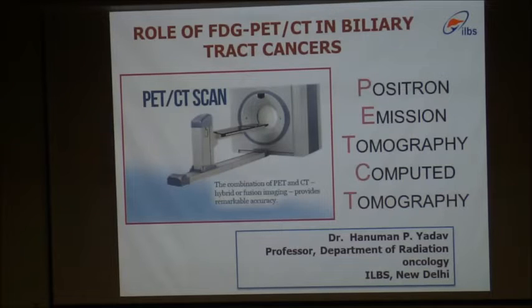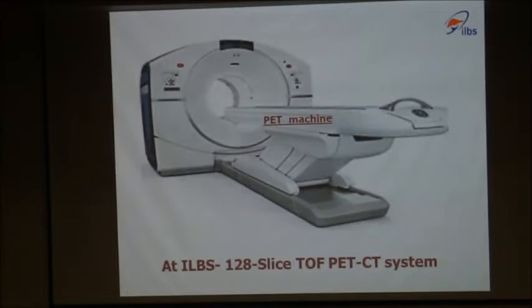Today I am going to present the role of FDG-PET CT in biliary tract cancer. Although the subject is related to nuclear medicine, I don't claim that I will be able to prove too much, but as per orders, I am there at your service.